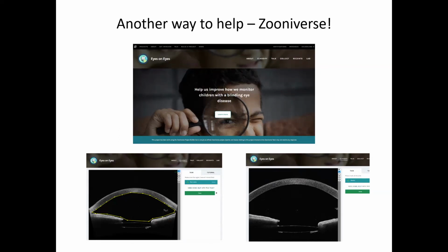The reason we're doing this is because those OCT machines are sitting in Specsavers, in Boots Opticians, on the high street right now, taking pictures of the back of the eye, but they are capable of taking pictures of the front of the eye. And it'd be absolutely incredible if you could go to your local opticians to get a scan that's sent to us or read by a cloud-based AI that gives an output of what's going on in that eye, so you don't have to travel hundreds of miles.